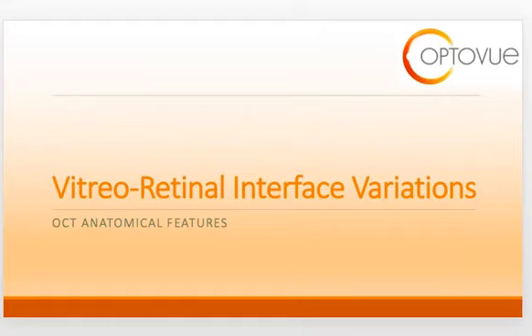Welcome to the second video in this series on OCT interpretation. I am Dr. Julie Rodman. In this segment, I will introduce the topic of variations of the vitreoretinal interface.